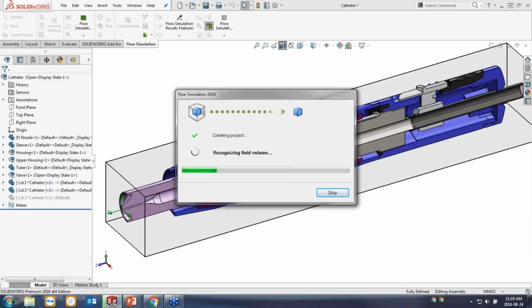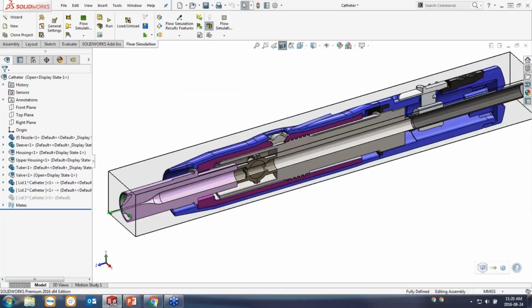So it's going through right now, it's figuring out my geometry, it's recognizing the fluid volume that's contained within the geometry since I toggled this as an internal analysis. And that's another great thing. I don't have to tell it where the fluid is. Simply by looking at the model, flow simulation is able to understand where there's fluid, where there's solid, and what I'm going to be analyzing. And so once it's done this process, we'll go through, we'll insert our boundary conditions, we'll run our analysis, and we'll start taking a look at some results.